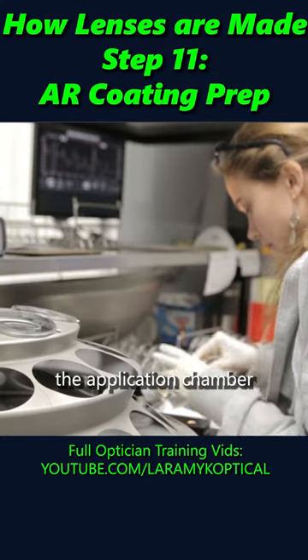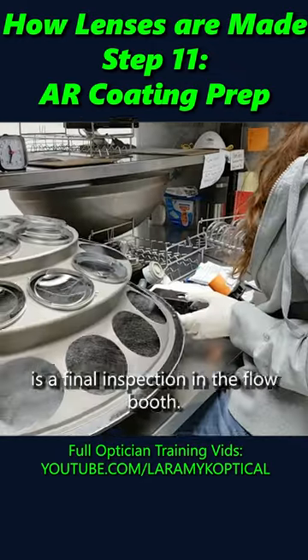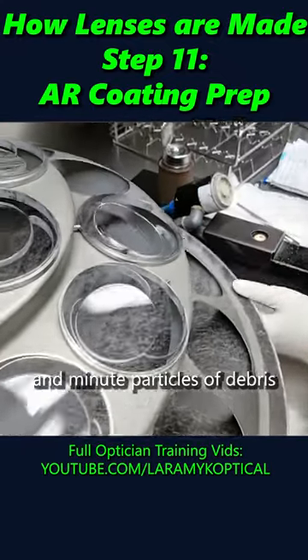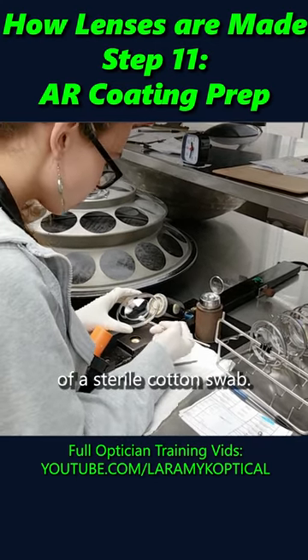The last step before entering the application chamber is a final inspection in the flow booth. The flow booth blows filtered compressed air across both surfaces of the lens, and minute particles of debris can still be safely removed with careful use of a sterile cotton swab.